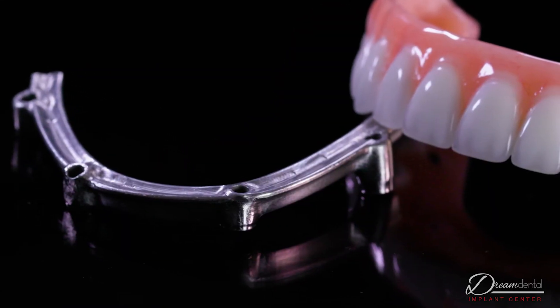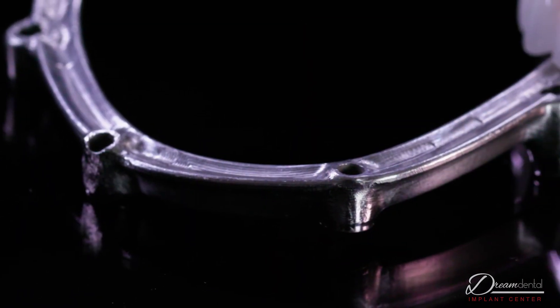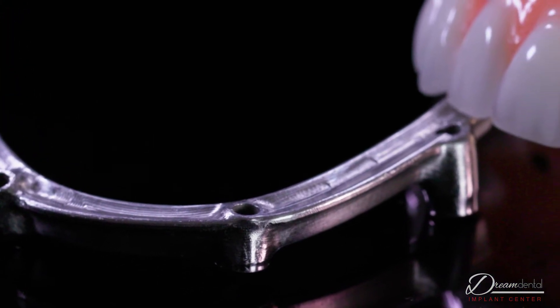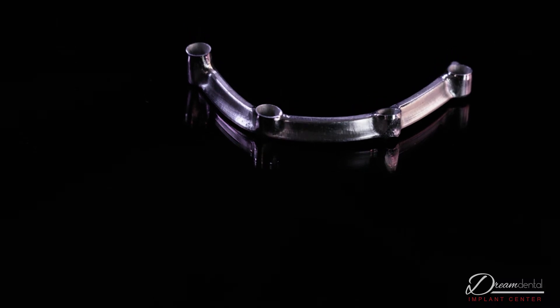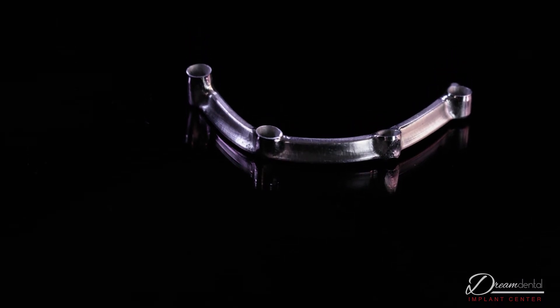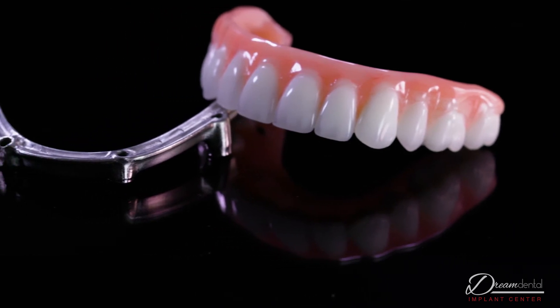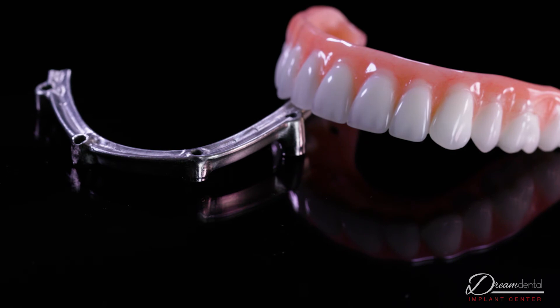The titanium is the gold standard in the industry, and it's been around the longest. It really is indicated for pretty much any patients, and is a great option for 99% of patients out there. What's unique about the titanium is that's where it gets its strength. When patients are putting a lot of money into a device like this, they always ask how long is it going to last. The titanium ties all the implants together, and that's what gives it the strength so that it lasts long term.